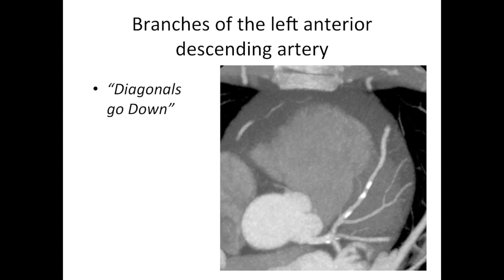The left anterior descending artery has some branches. There is a branch here, and also these little tiny branches on this side. There's an easy way to remember what to call these branches — a great radiologist in Edinburgh told me: diagonals go down. Very simple and easy to remember. This is a diagonal branch because it's going down. This is the front, this is the back, this is going down — diagonals go down. So this is a diagonal branch.